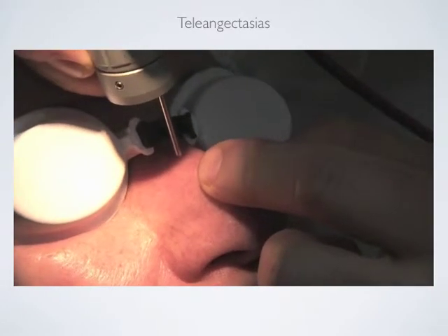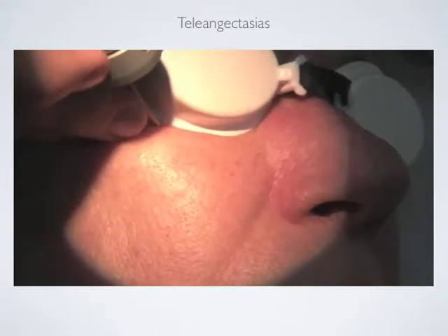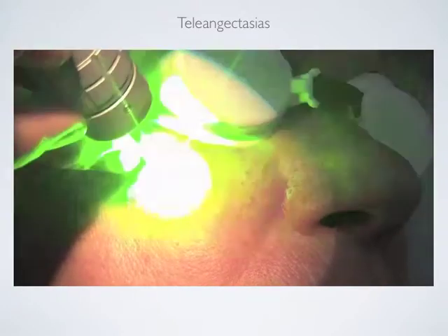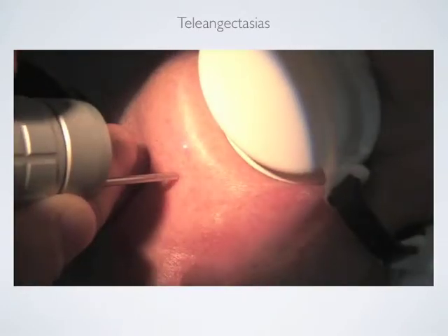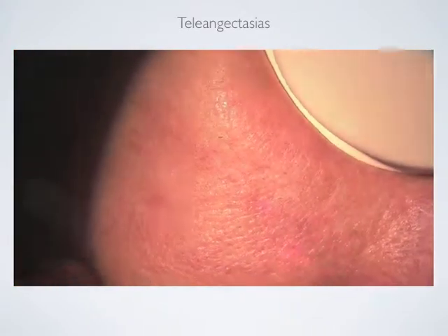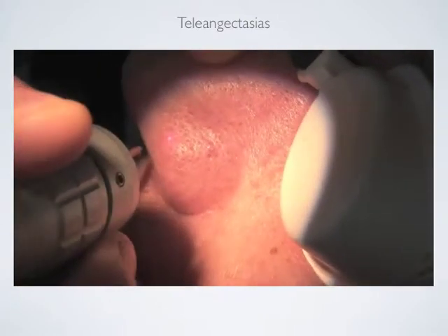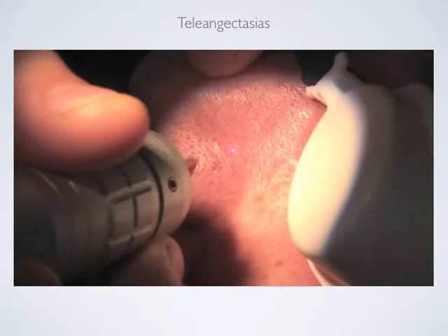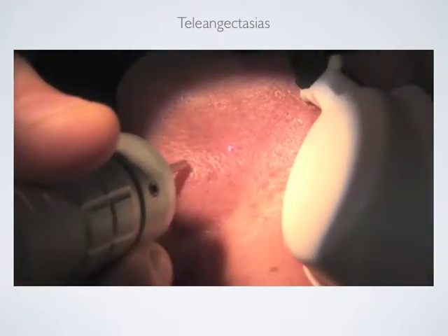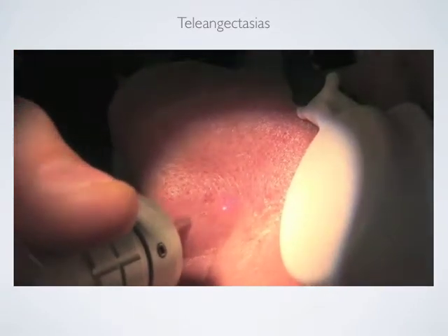Sometimes, according to the patient's tolerability, you can speed up the treatment. You can either start from smaller or bigger vessels — it makes absolutely no difference. The endpoint is to see the telangiectasias disappear without any skin changes; there should be no change in its color. Another advantage is that if you see hyperpigmentation around the area, you can treat them without changing any setting of the machine and they become darker.